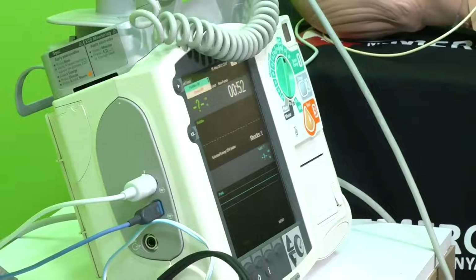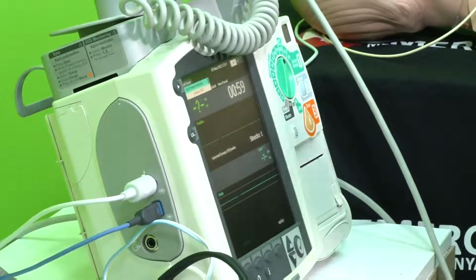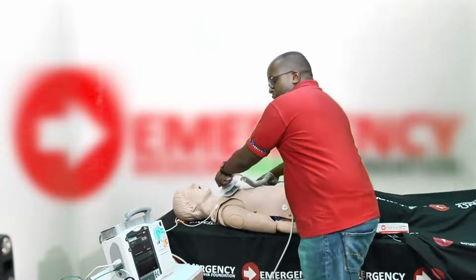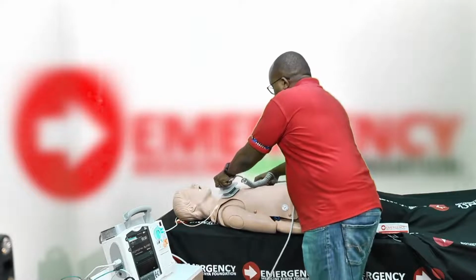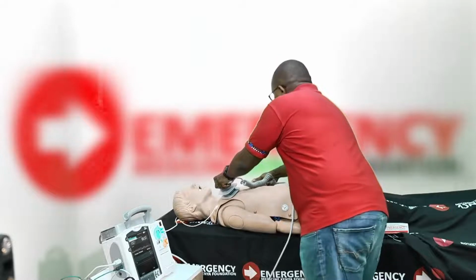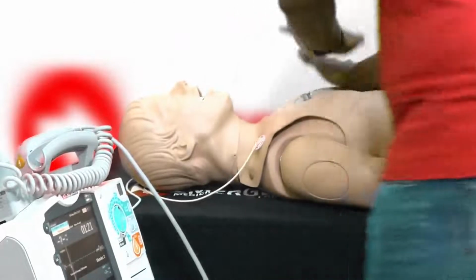Let me repeat that again for you to see. The first thing is, the patient has just collapsed, so CPR is ongoing, there's no pulse, so we have started CPR. I want to quickly check the rhythm. I still have some gel on. I'll check. My patient is in ventricular fibrillation, so this patient needs to be shocked. I'm going to charge it. It's turned up to 150. I'm going to charge to 150. Clear everyone. Shock, and I put them back, and resume CPR.